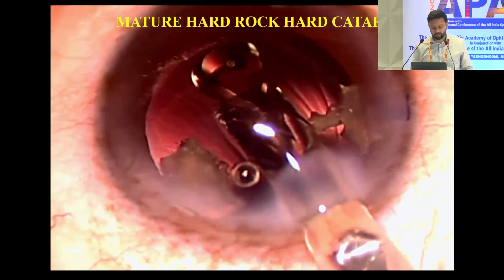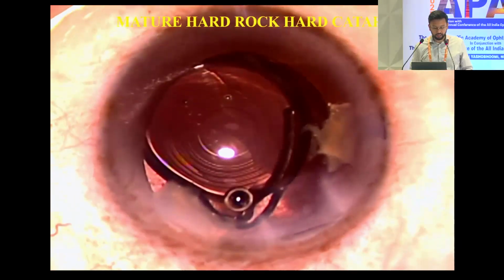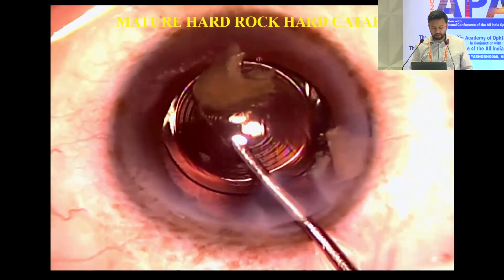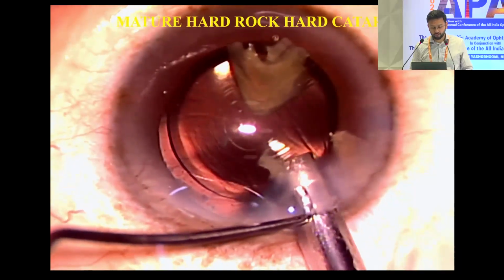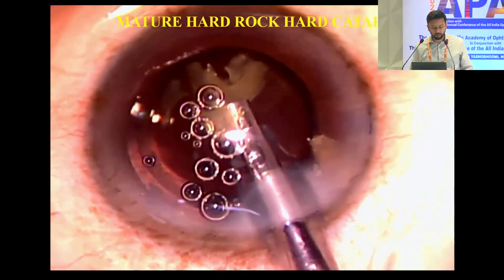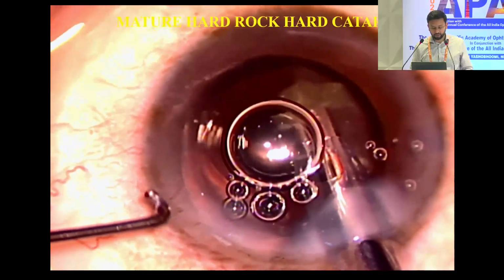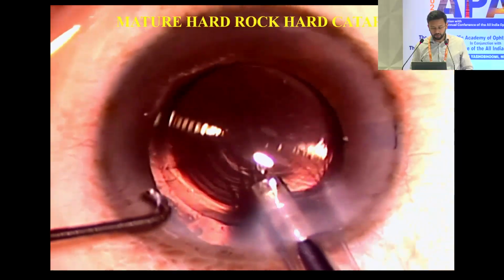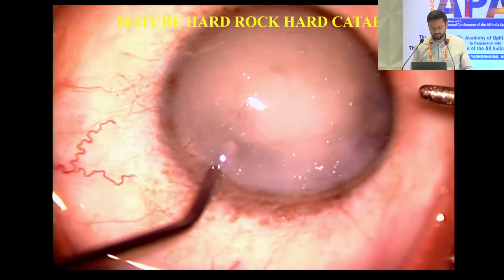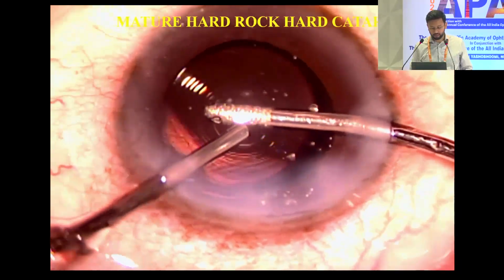We are going forward with the plan of implanting the multifocal IOL. In this case, we carefully implant the IOL in the bag, and here the IOL also acts as a scaffold to hold the vitreous back, and also as a base to emulsify the rest of the fragments without loss of any fragment into the vitreous. So here we were able to complete the case with good visual outcomes. Of course, we have to ensure that there is no vitreous in the AC by staining with triamcinolone crystals.